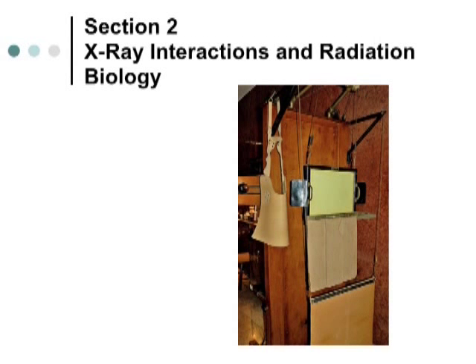This is an old-fashioned fluoroscope. This is from 1925. And this is the actual fluorescent screen. The X-ray tube is back here. This is on cables, and the radiologist would stand in front of this and hold it in his hands and then move it up and down in front of the patient.